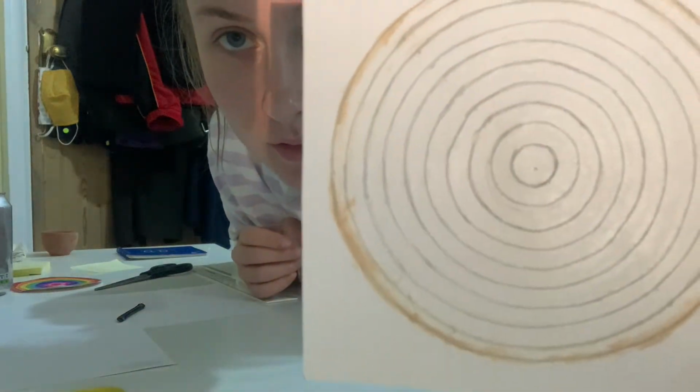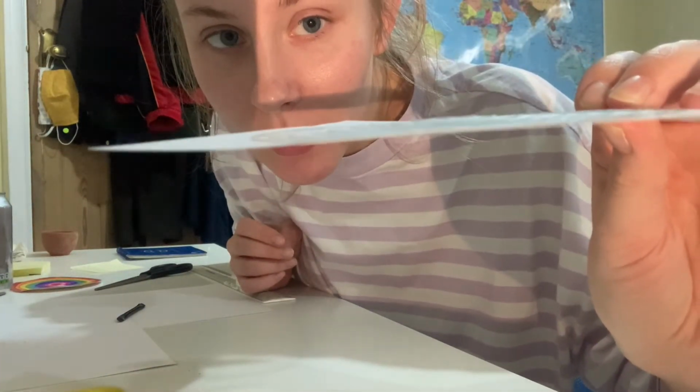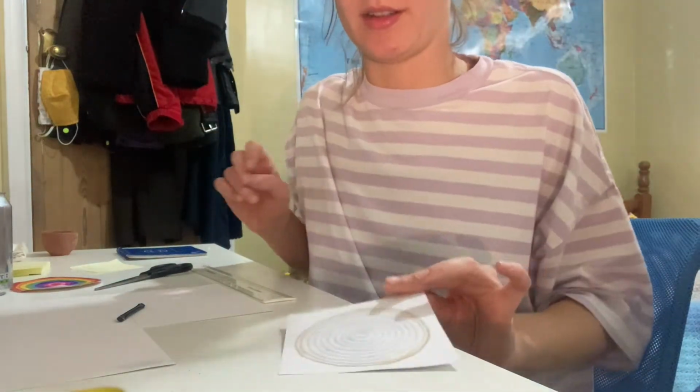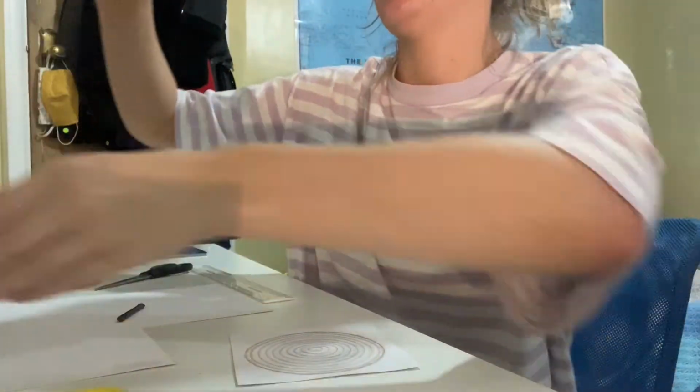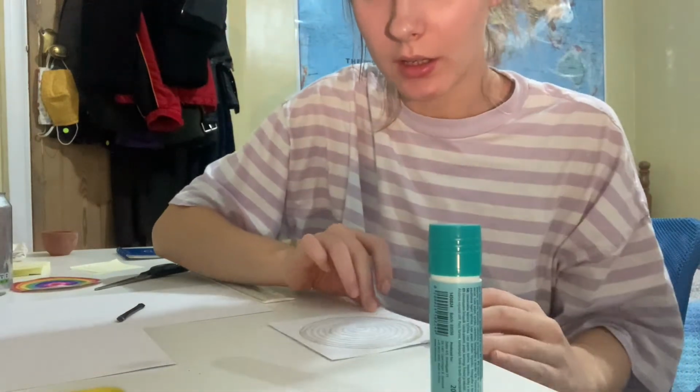I've done all of the little ridges now, if you can see those. The middle one is so hard. That one took me so long. My back is hurting.